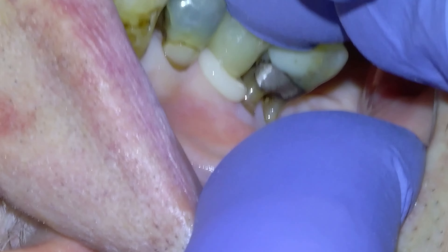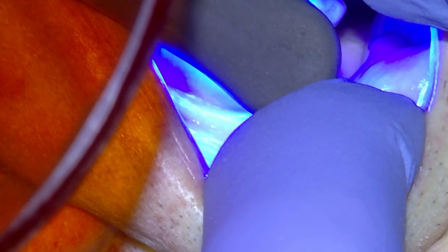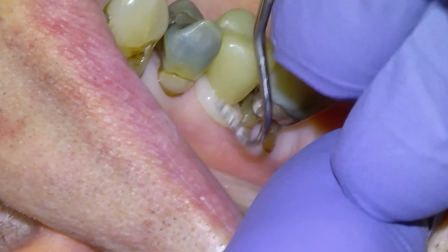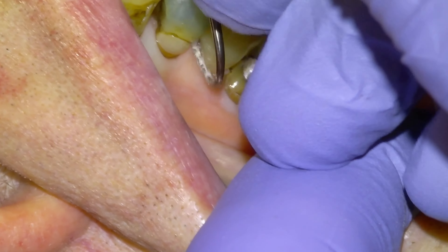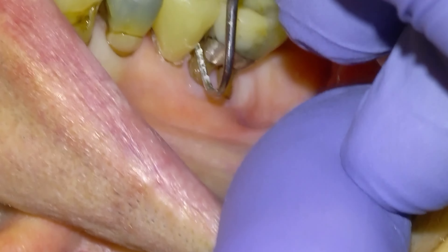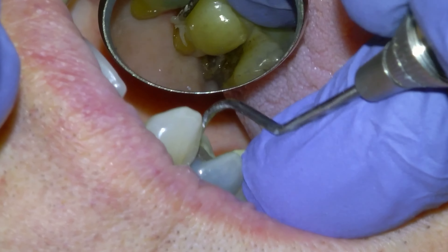There's the tooth cemented — we're just going to tack cure it with the Valo, clean it up, and then tell the patient that thing's going to be with them for life. I'm still looking for video editors, in case anybody is interested. I have way more cases than I have time to edit, so if anybody is an editor, please feel free to reach out and we can make more of these.